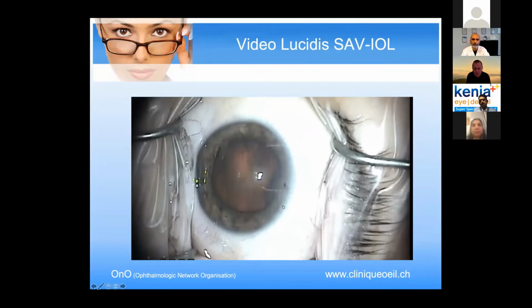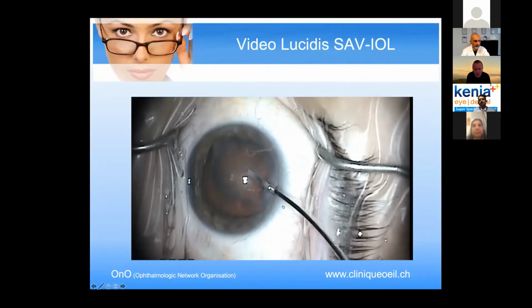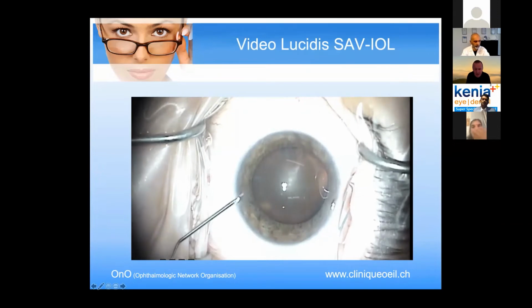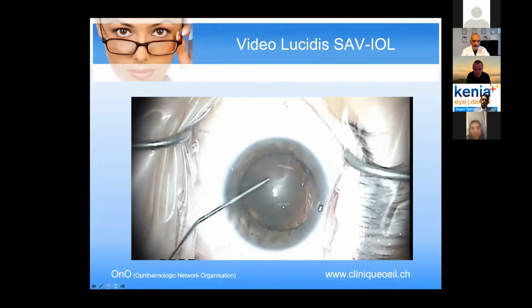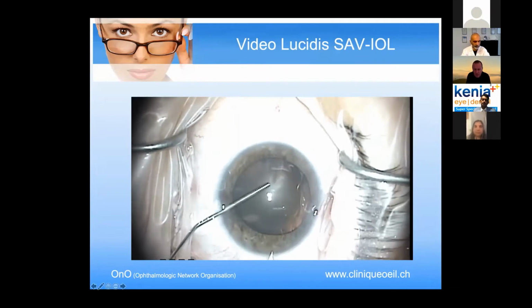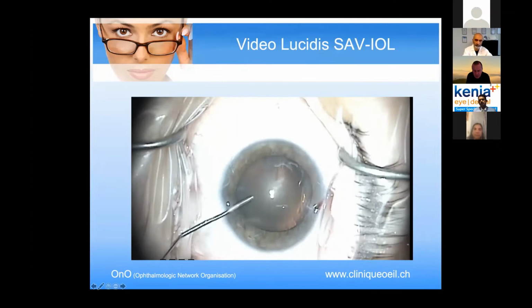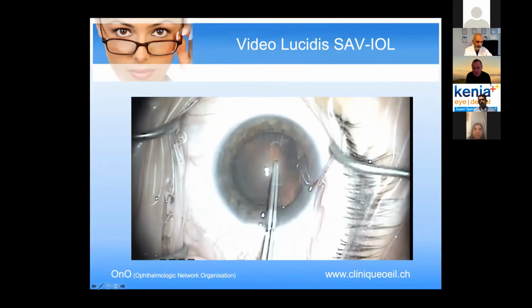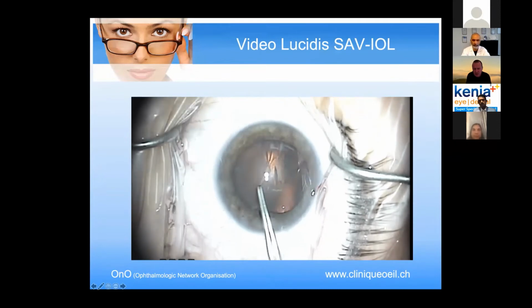I will show you the operation that we do quite daily in our clinics. We do 2 paracenteses. We put some anesthesia inside the eye. We put in the dispersive OVD, and we make a 2.0 incision on the temporal side. For the Lucidis, we increased to 2.2 at the beginning, and now we succeed with a 2.0.